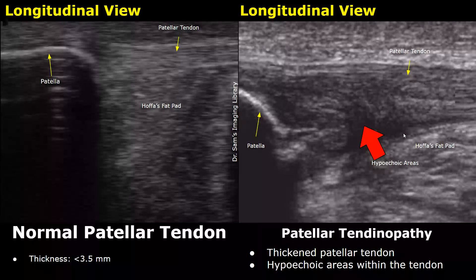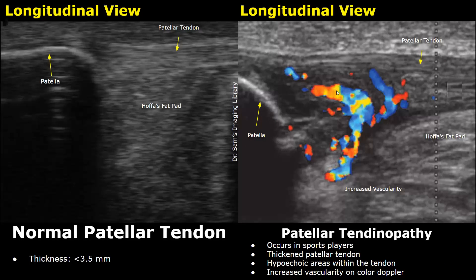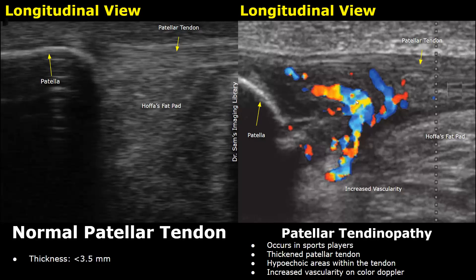This is another image of patellar tendinopathy showing hypoechoic areas at the proximal aspect of the tendon, and it is thickened as well. When color Doppler is applied, we will see increased vascularity in the affected area. Normally no significant Doppler signals are found within the tendon, but in tendinopathy, due to inflammation, increased vascularity is seen.